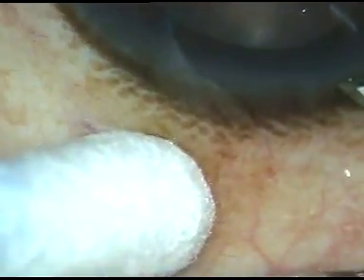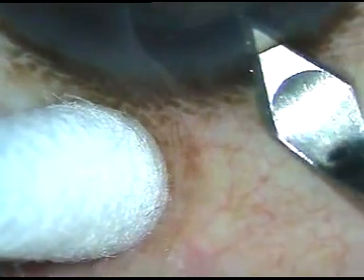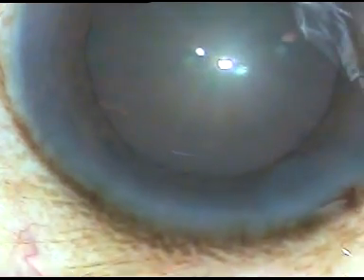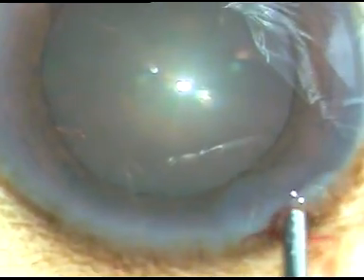Dear colleagues, this is phacoemulsification of a soft cataract. In soft cataracts, it is very difficult to hold the nuclear mass, and since we cannot hold it nicely, we cannot slice it. We cannot divide the nucleus with a chopper.